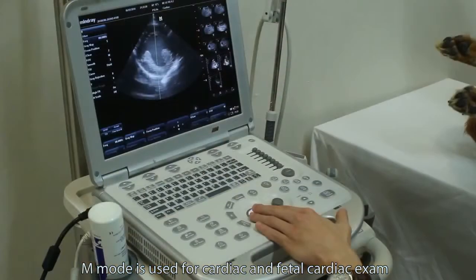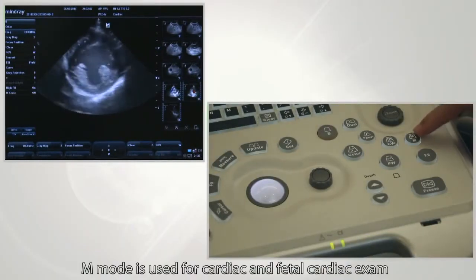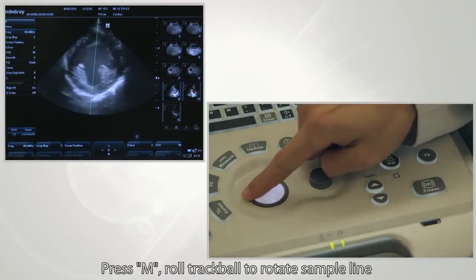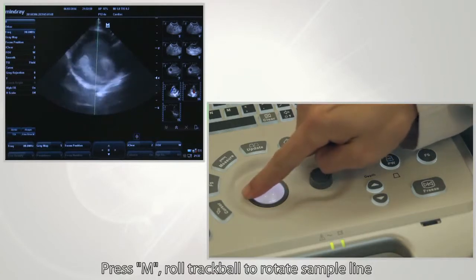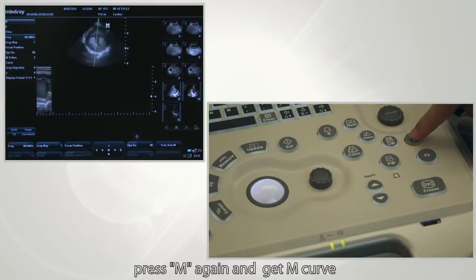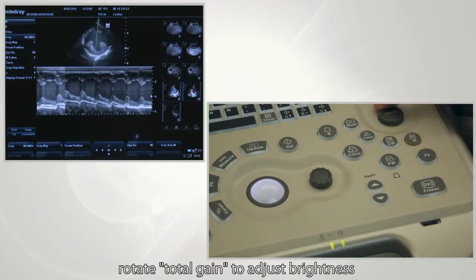M mode is used for cardiac and fetal cardiac exams. Press the M button, roll the trackball to rotate the sample line, then press M again to get the M curve. Rotate total gain to adjust brightness.